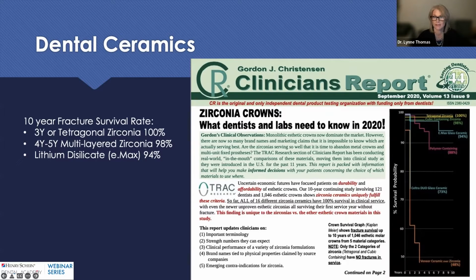However, as a CEREC dentist, you want an assortment of different materials because there is not one formula for teeth. They come in different shapes, sizes, and translucencies. So it's always nice to have a couple of different types of blocks available to you when you're doing CEREC dentistry.